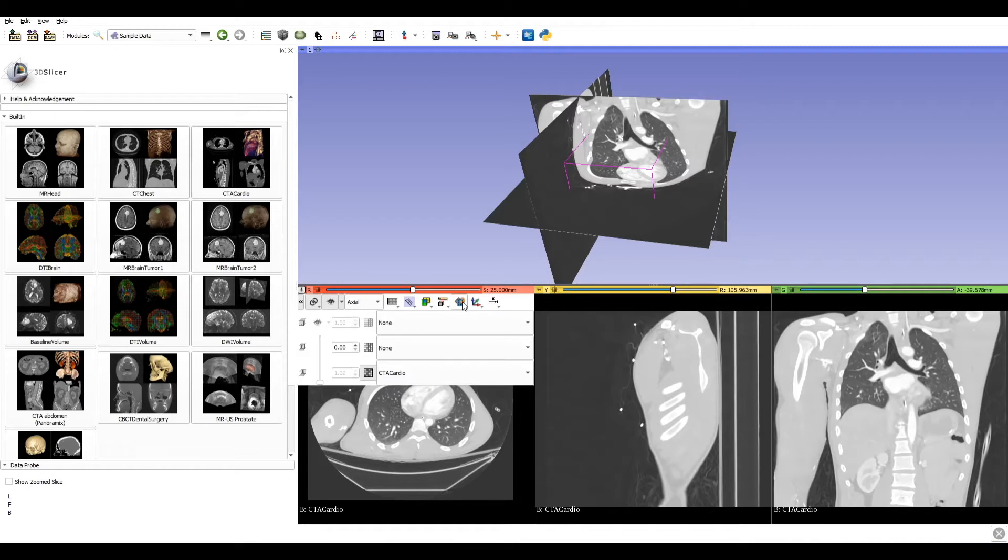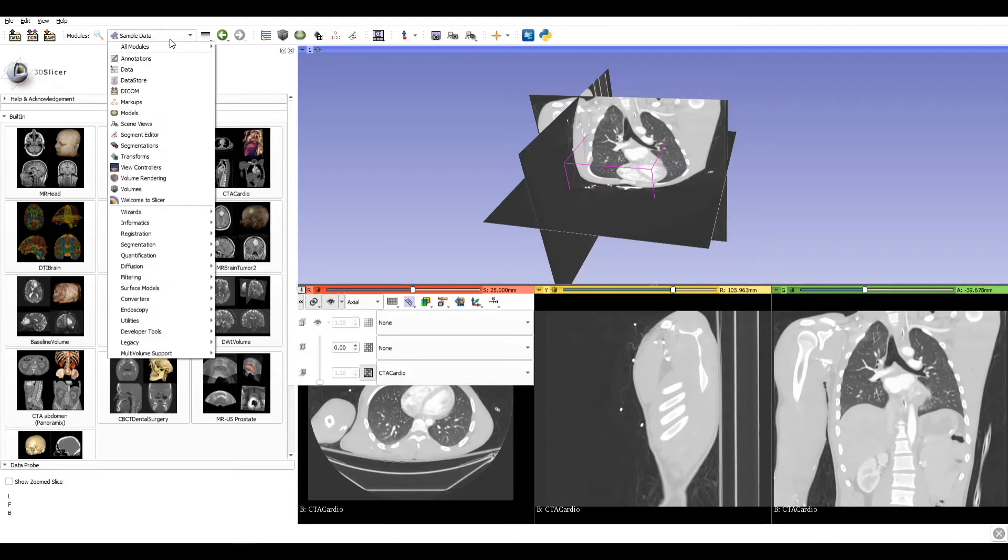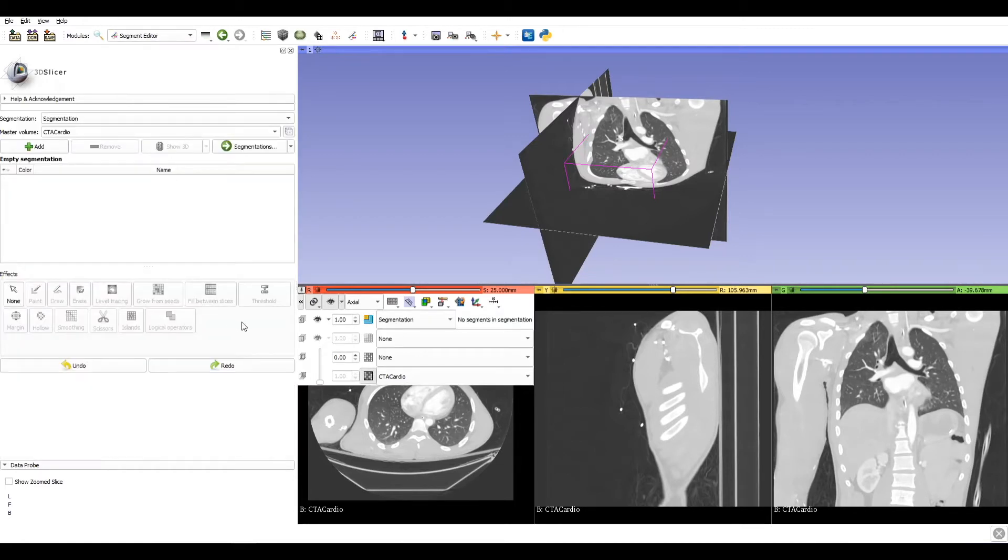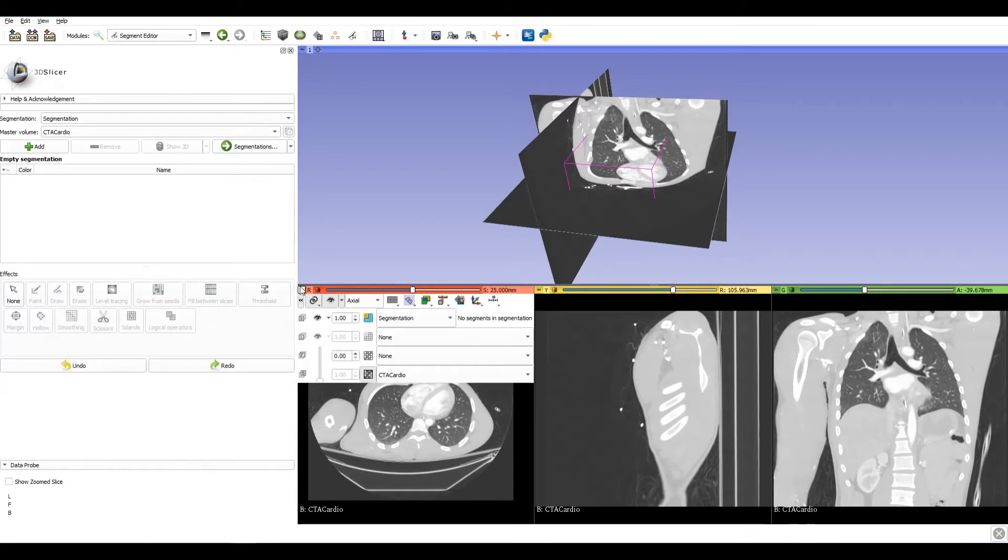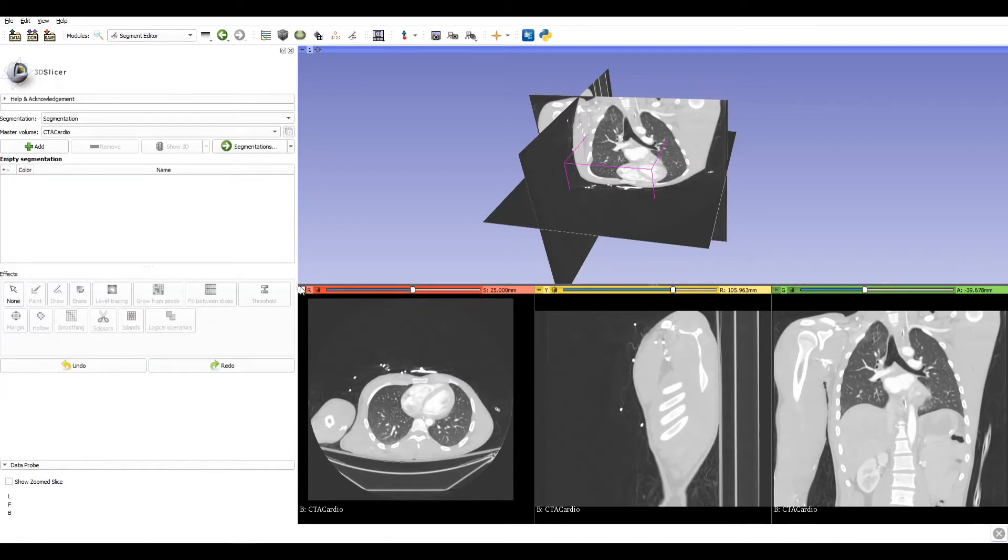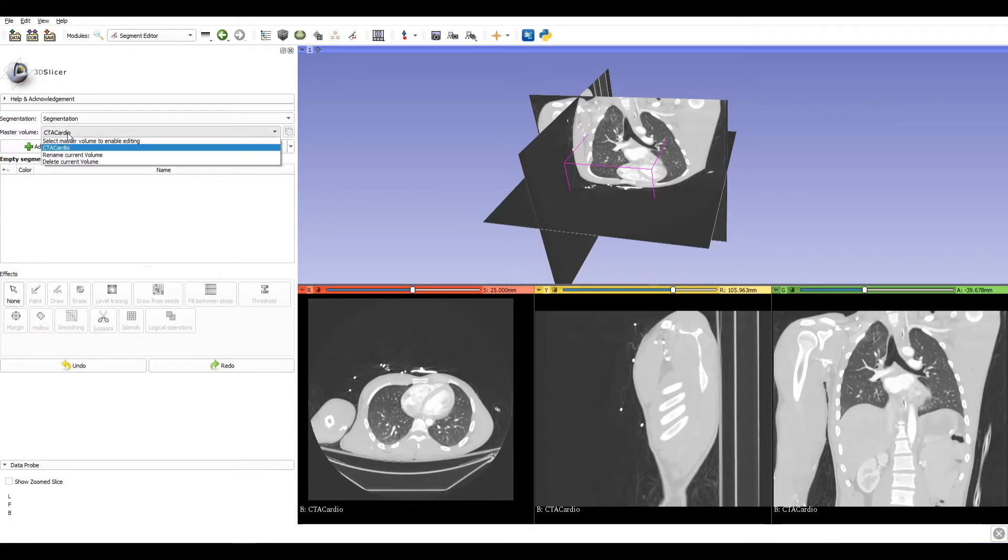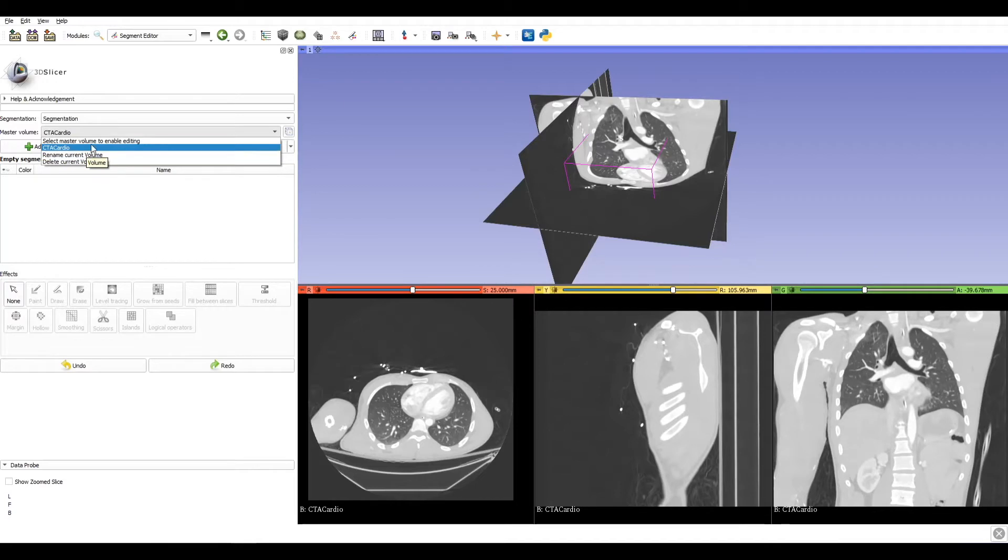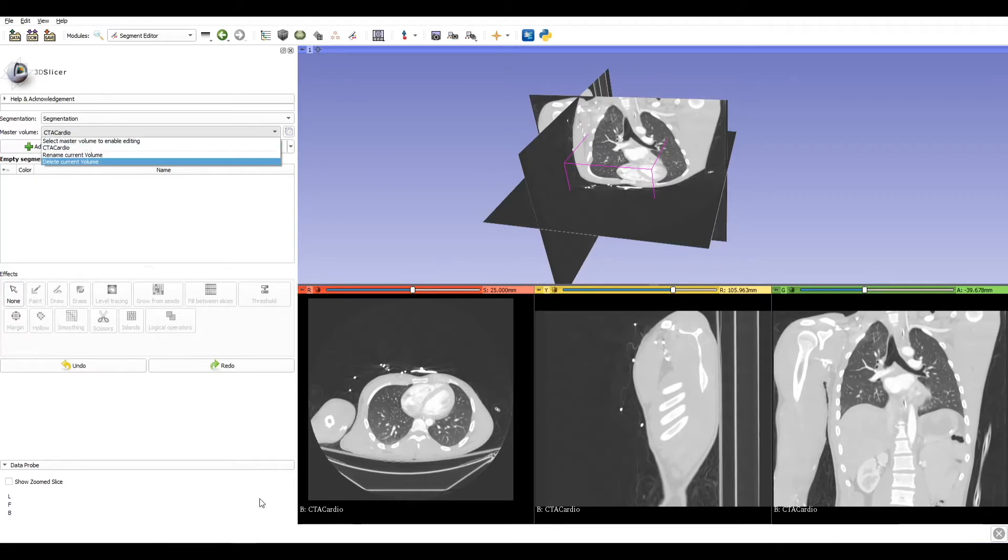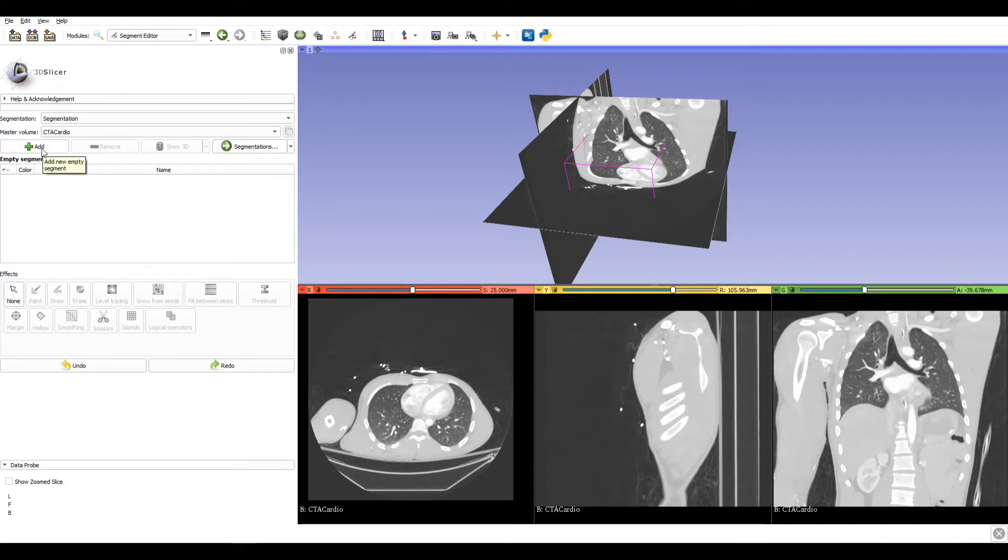Now let's move to the segment editor module. Go in the dropdown menu and select segment editor. Here we can find many functions. In master volume, we choose which data we are using. Take care to check if it's the same. And here we can add a new segmentation.